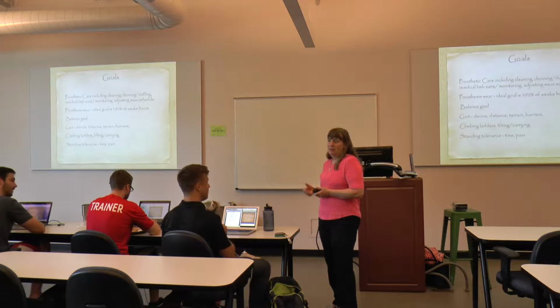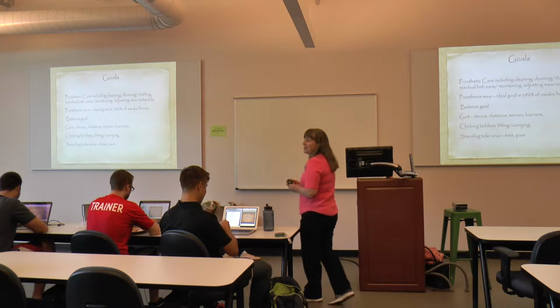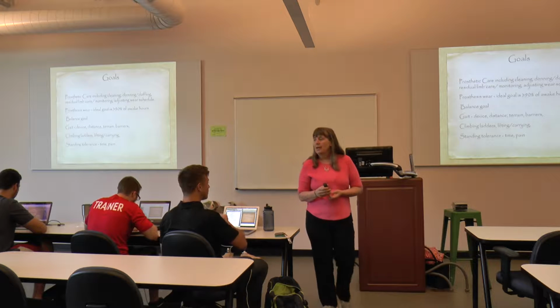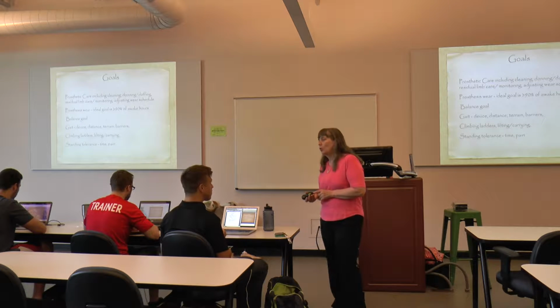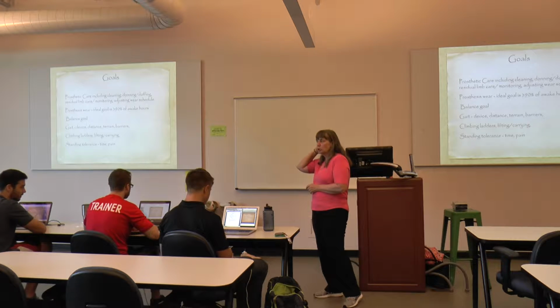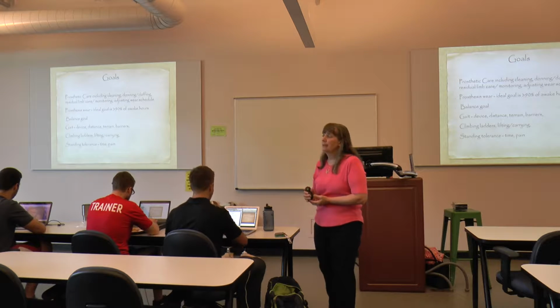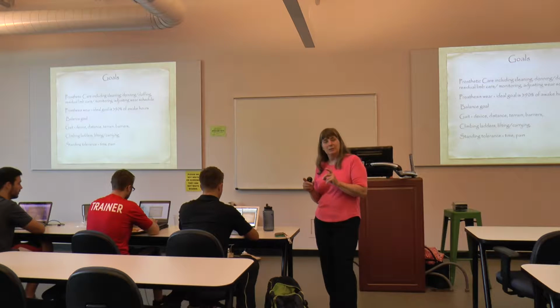Patient is able to verbalize and demonstrate independent prosthetic care to enable safe use of the prosthesis without pain or skin issues. So then my short-term goal might be the patient is able to demonstrate proper donning of the prosthesis and verbalizes proper cleaning. What's the difference in my verbiage there?